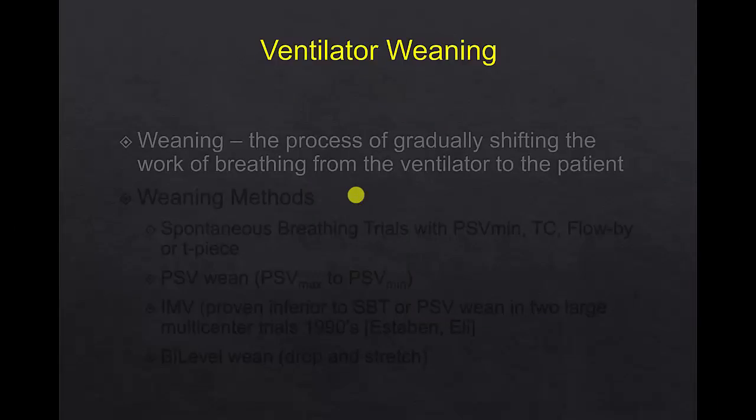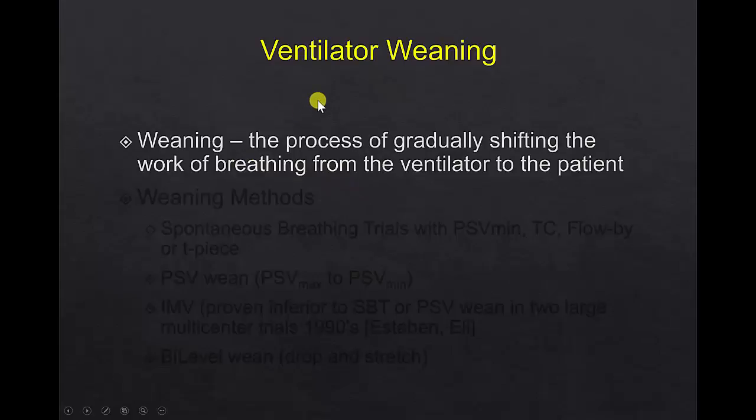So I'm going to go over some basics of ventilator weaning. It's a whole topic unto itself, but I thought I would go over a couple of slides. Weaning, I would define as the process of gradually shifting the work of breathing from the ventilator to the patient.